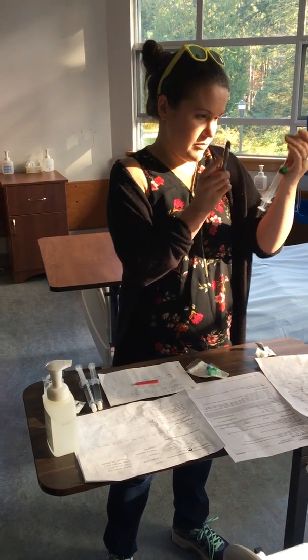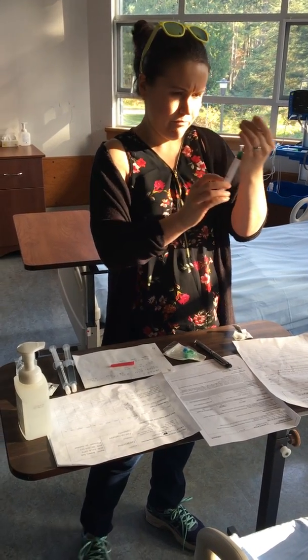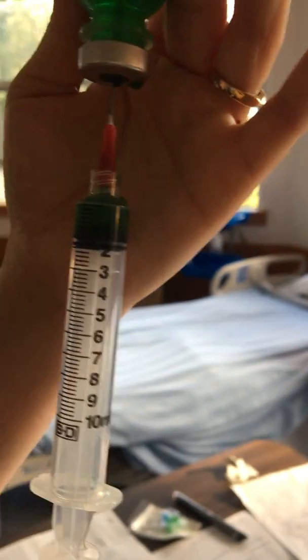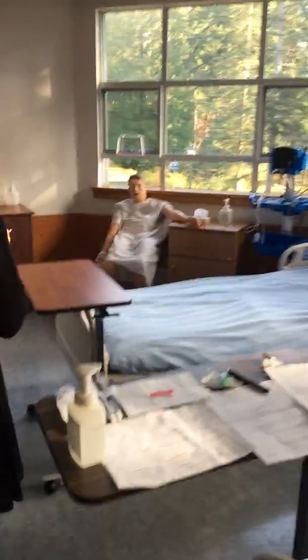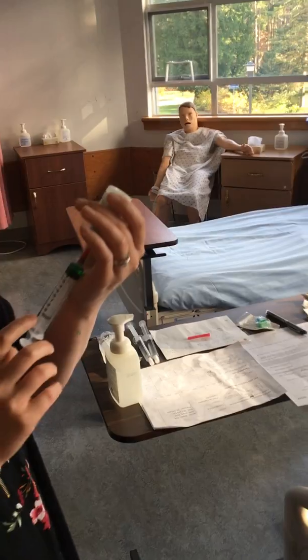Get the air out of it. Okay, then show my camera that it's 1 ml. It's dark in here. Oh, there we go. Now it's 1 ml. Turning the lights on would be helpful in this hospital. Oh, it's like leaking. Oh, you know what? It's pushing back on me. That's why I'm not getting the right dose. So it's pushing back on me.